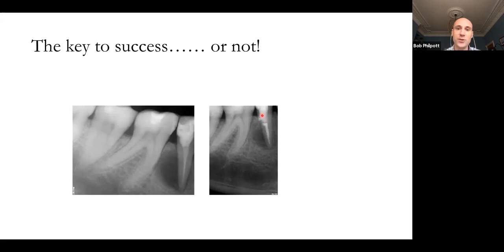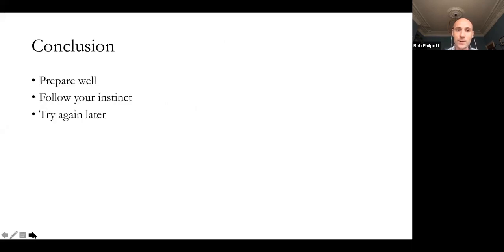I spoke to the patient, I explained what happened, I talked them through it, and I said, I've repaired it really quickly. I've used a biocompatible material, let me correct myself, and I did correct myself, get into the right spot, couldn't achieve patency, but the end result is satisfactory. And the end result is a biological result, and it's not just about getting this perfect access done in a virgin tooth. You've got to appreciate that sometimes we're going to encounter problems. All of us will, and it's how we deal with them that's important.